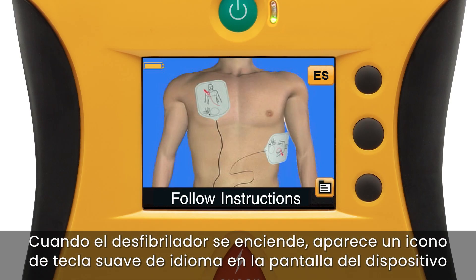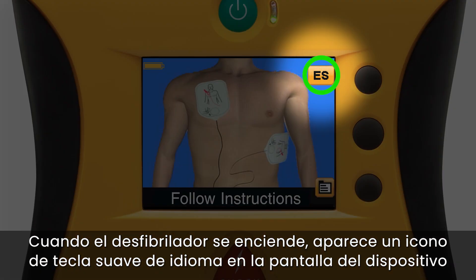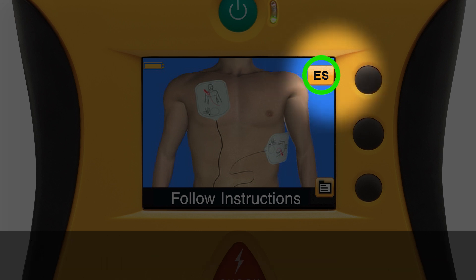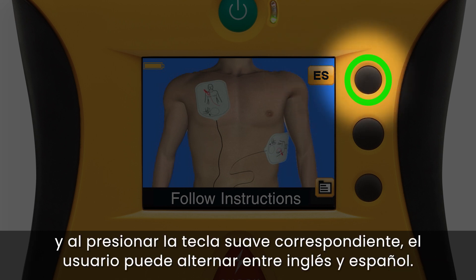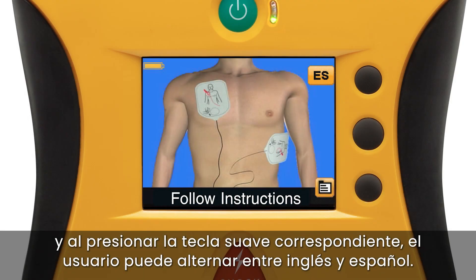When the AED is turned on, a language soft key icon appears on the device's screen, and pressing the corresponding soft key allows the user to toggle between English and Spanish.